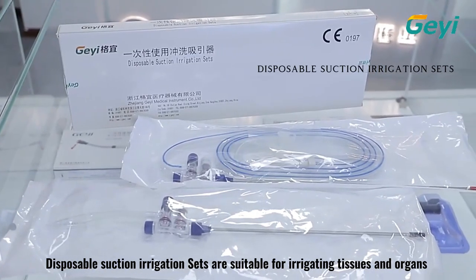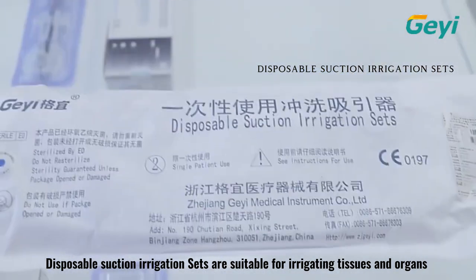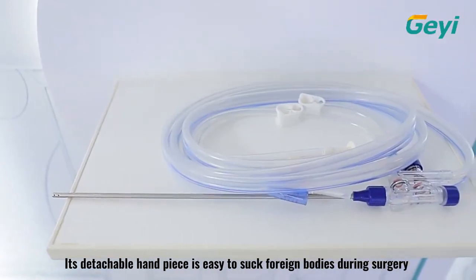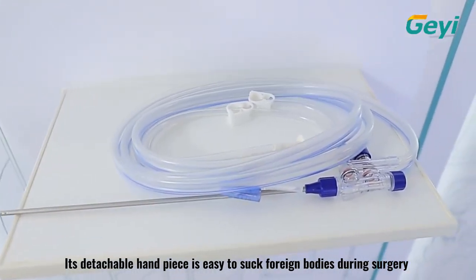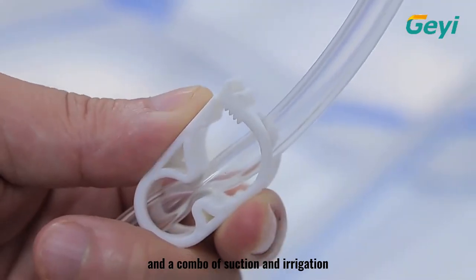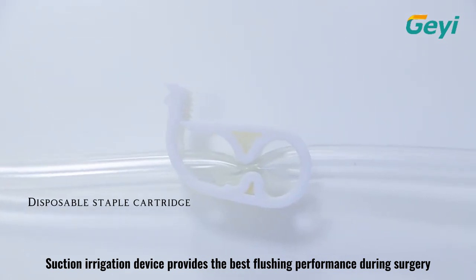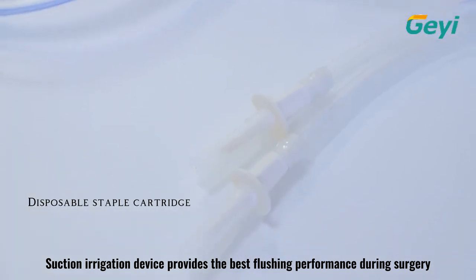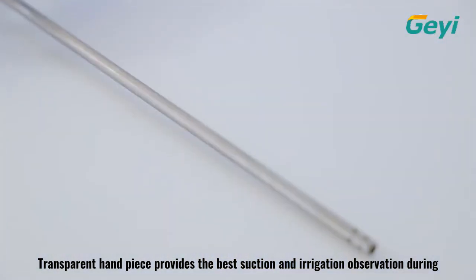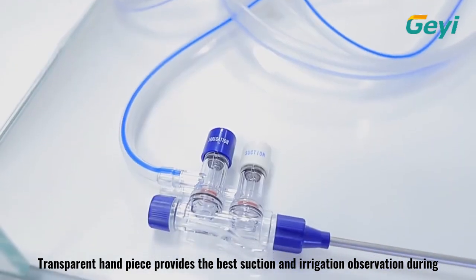Disposable suction irrigation sets are suitable for irrigating tissues and organs and sucking waste fluid in surgery. Its detachable handpiece is easy to suck foreign bodies during surgery, combining suction and irrigation. The suction irrigation device provides the best flushing performance during surgery, and the transparent handpiece provides the best suction and irrigation observation during surgery.